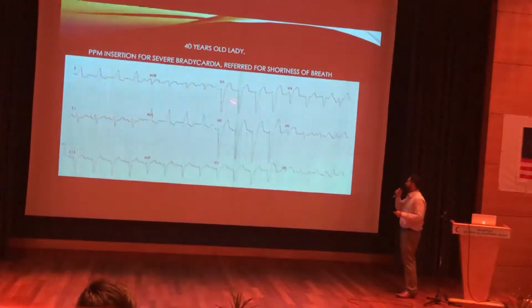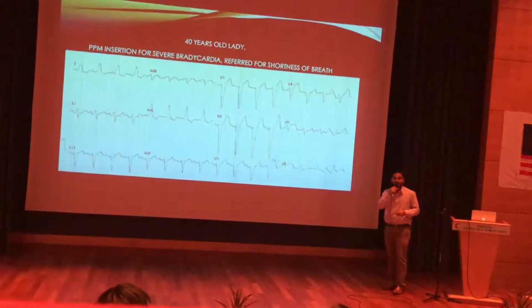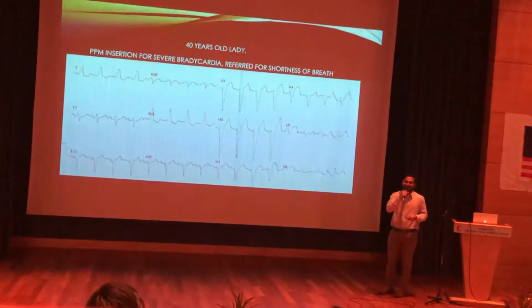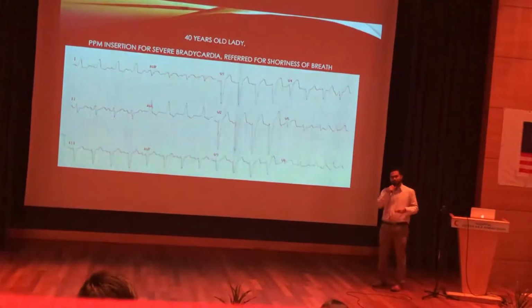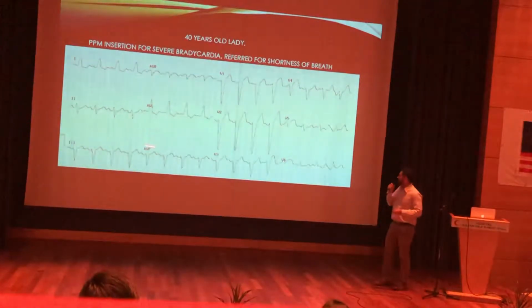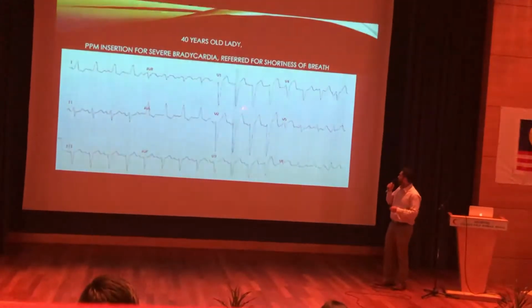What is striking? Oh, look. Is the rate regular? Yes. Regular, yeah? QRS seems a bit wide, do you think? Right? Yeah. The S wave, the R wave, everywhere seems very bizarre, right?